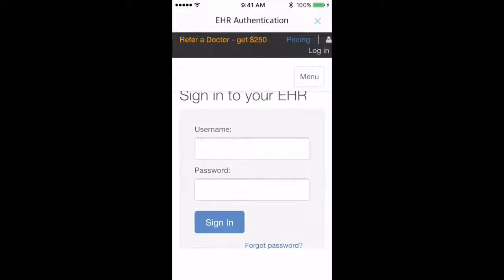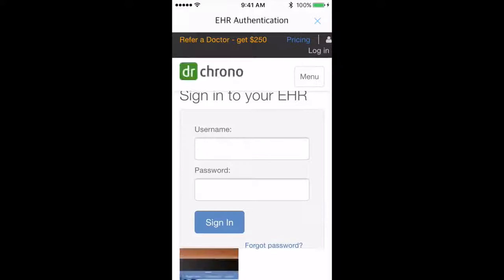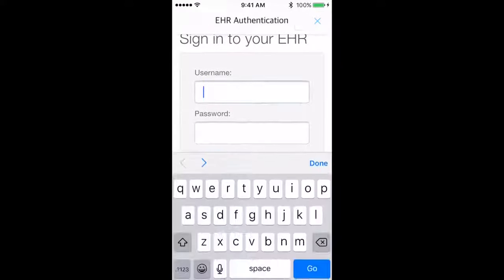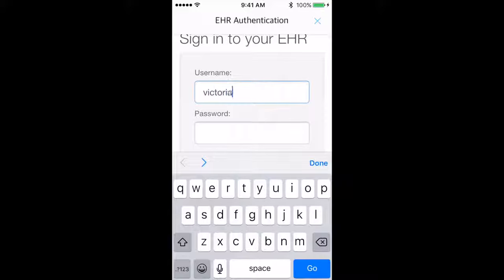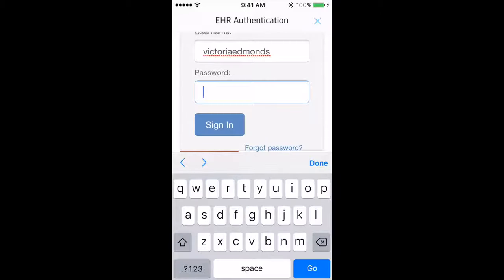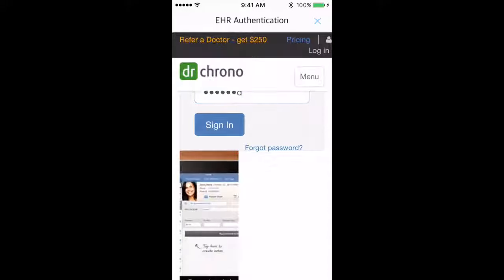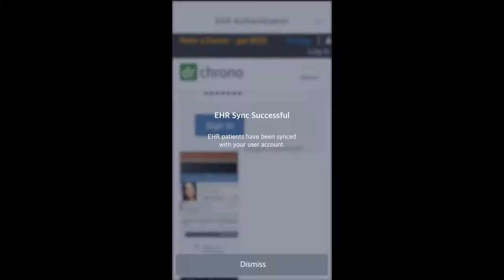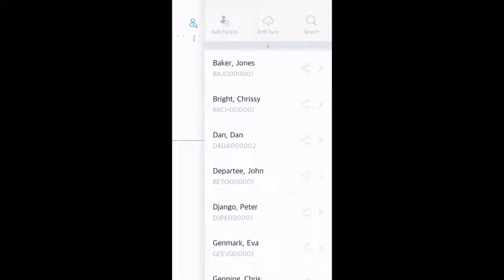You will now be prompted to sign into your Dr. Chrono account, which will allow ECHO to pull down your patient list. Depending on how many patients are associated with your Dr. Chrono account, this process could take a few minutes. However, you will be able to use your ECHO app normally while the sync completes.